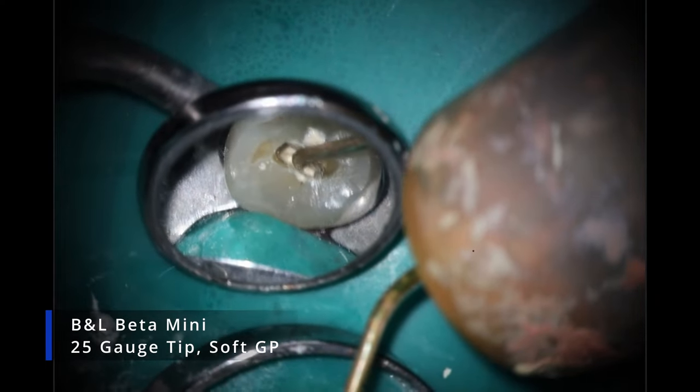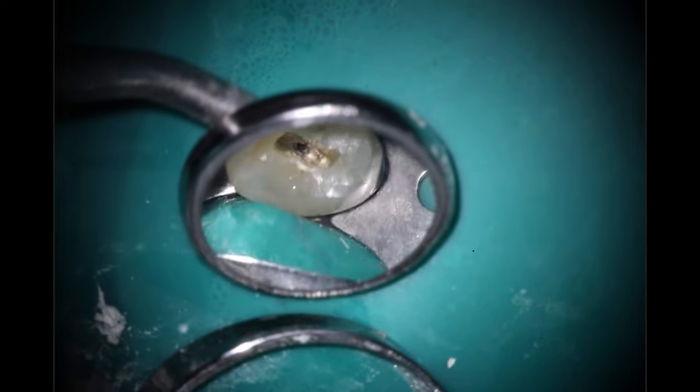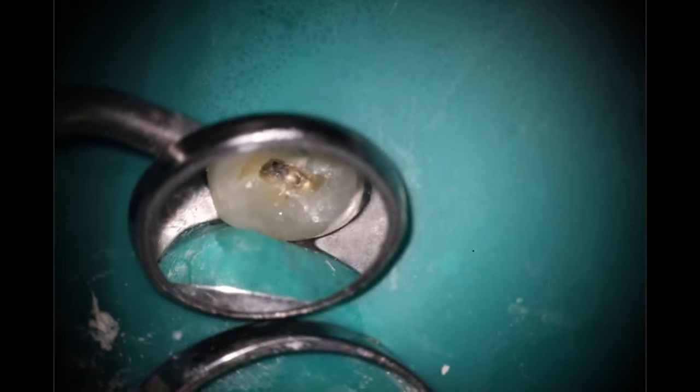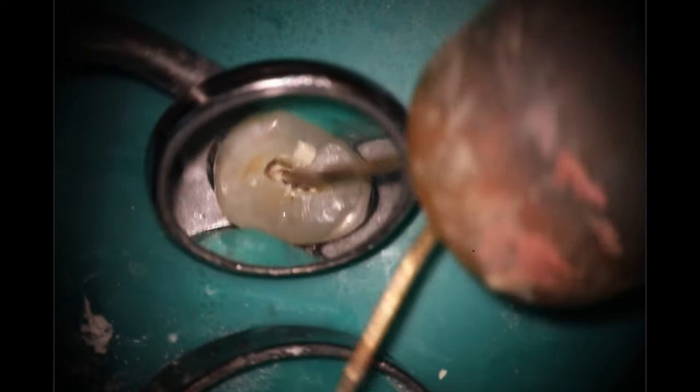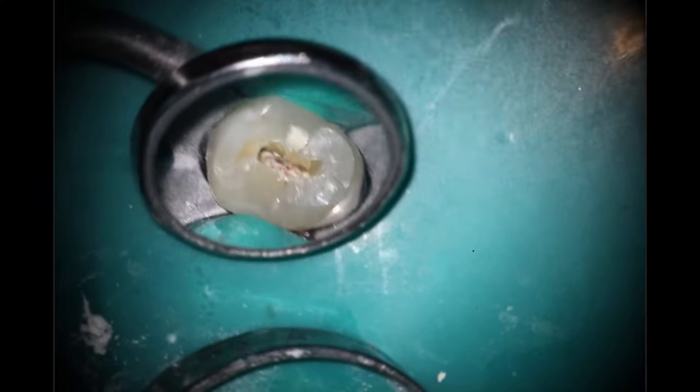Now we're going to come in and do our squirt technique — B&L Beta Mini for this one. Make sure you use that soft gutta percha approach; I run this at 230 degrees so it's nice and hot. Then come right back in with the plugger. You notice there's a gap there because there was no gutta percha in it. One thing I love about this device from B&L is how quick it is to reload — that little pause is how long it took to pull it out, put a new gutta percha pellet in, and you're good to go. Calamus users — that's not going to be an option for you.